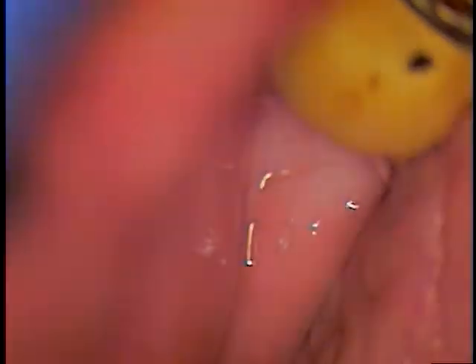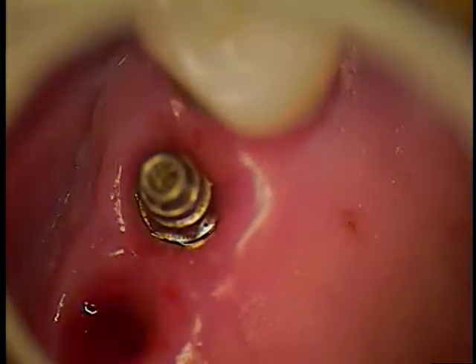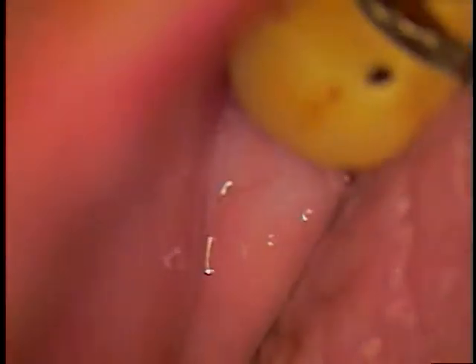Sink the driver, gently return. This is just hand screwing. Okay, so that one's just about out. Let's just see if we got it. Not quite. We have the driver though, for sure.